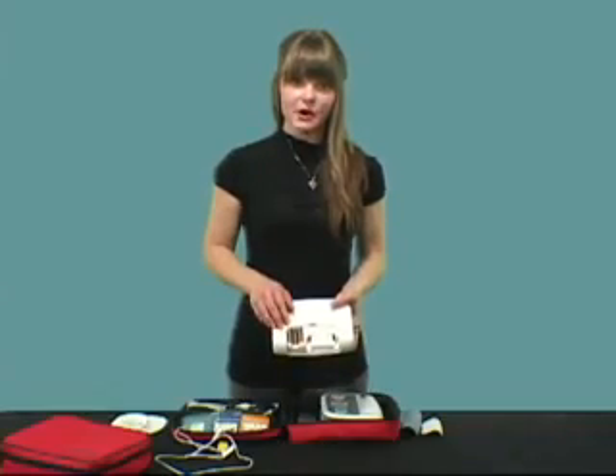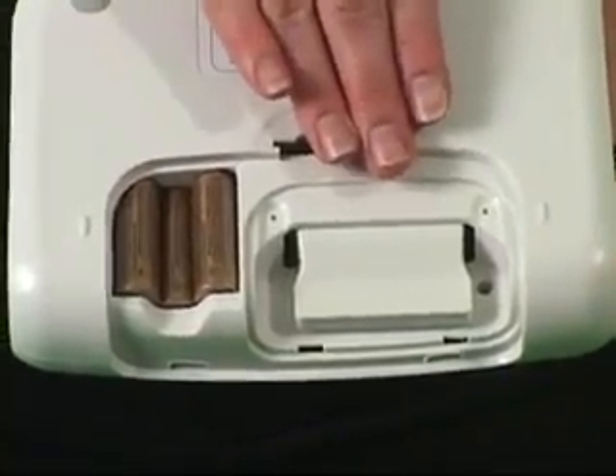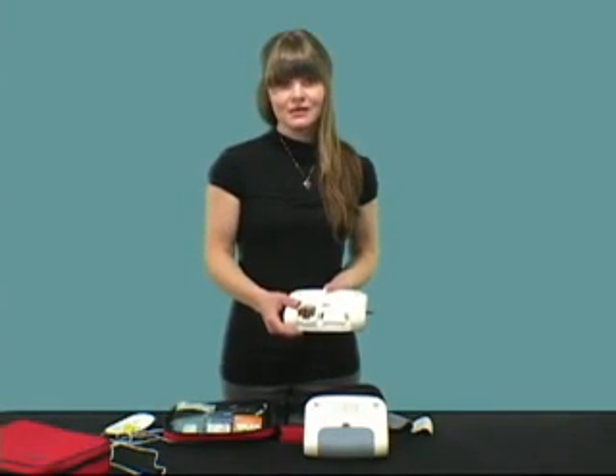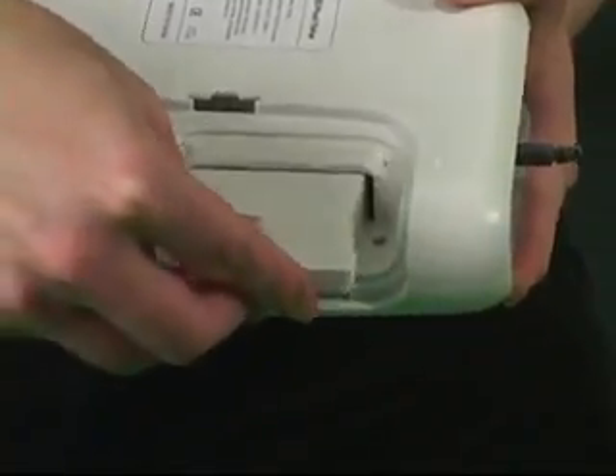On the back is a compartment for the batteries and the language scenario module. The PractiTrainer holds two different languages. Language modules come in many different language combinations. If guidelines change or you want different languages, for a nominal fee, you can purchase a language module and simply replace it in your device.